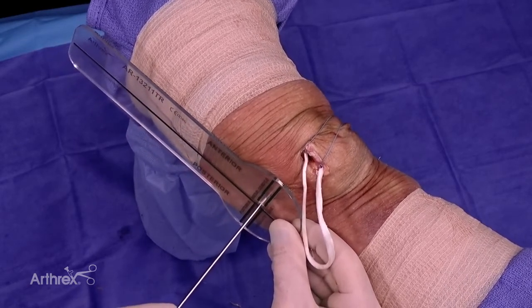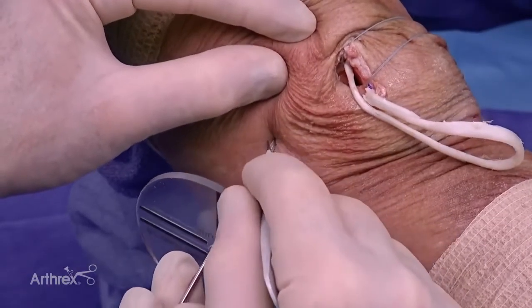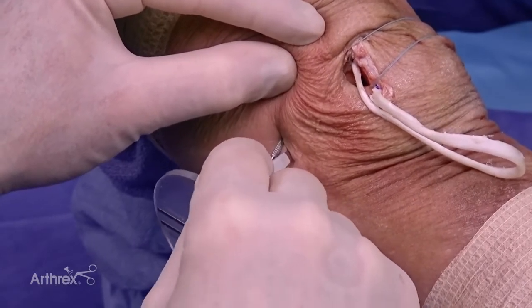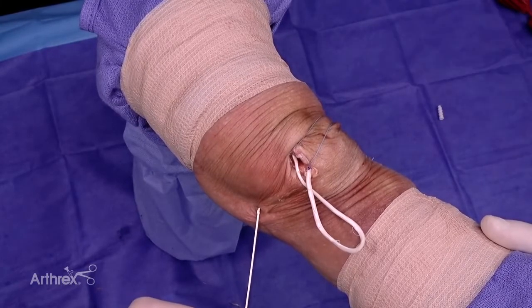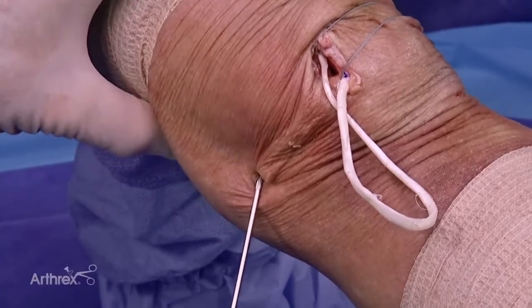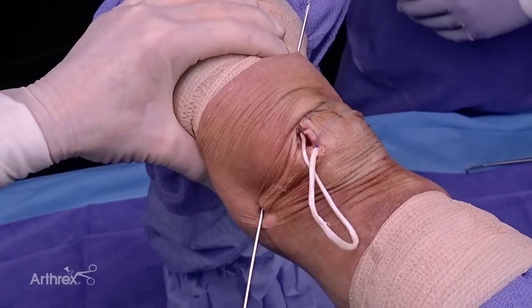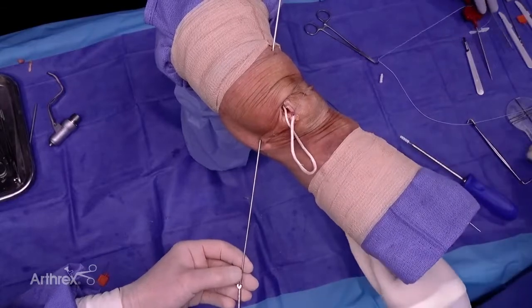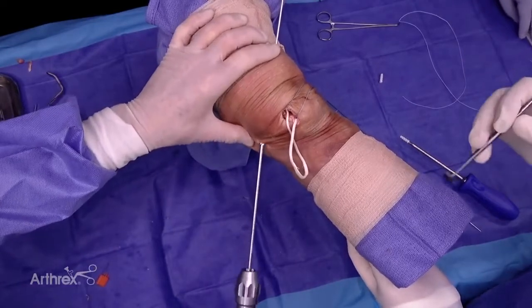We've found the isometric point and now I've got my pin in position. I make a little incision at this point — this is for my femoral isometric attachment point for the graft. I like to drill at a slight angle, posterior-medial to anterior-lateral. Now that I've got my isometric point I drill — a little bit posterior-medial to anterior-lateral. We use a 7.0 low-profile reamer to ream over the pin.